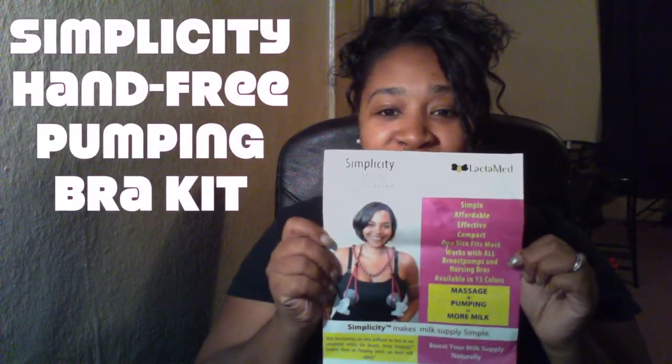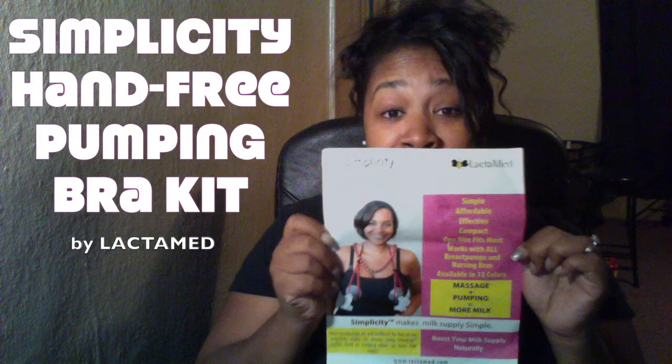Hey everybody, OVW here, and as you can see from the title, it's a review slash giveaway. So you're probably like, what am I giving away? This is the Simplicity Hands-Free Pumping Bra Kit.